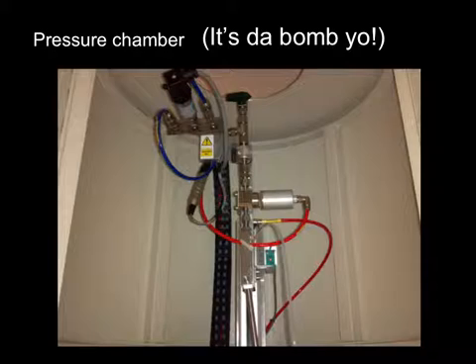So if you think about it, it's the exact opposite of what's going on with the sample that's down in the DNP apparatus. That's going to very low temperature and very low pressure. And up here you've got your solution that's at very high temperature and very high pressure, right? Because you've got to cancel that out basically to get to a liquid state sample that you can inject into a living system. So this will take a couple minutes to reach that temperature.